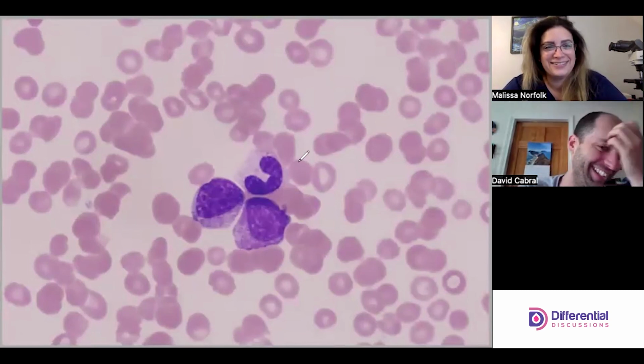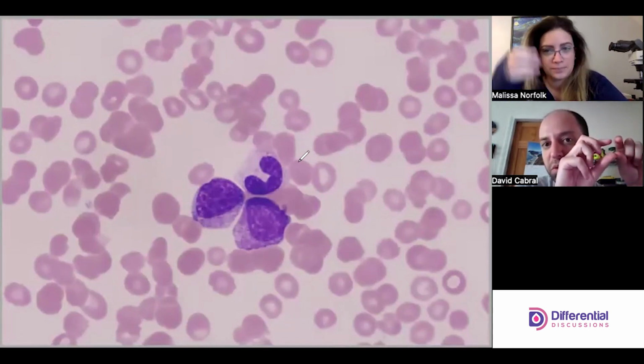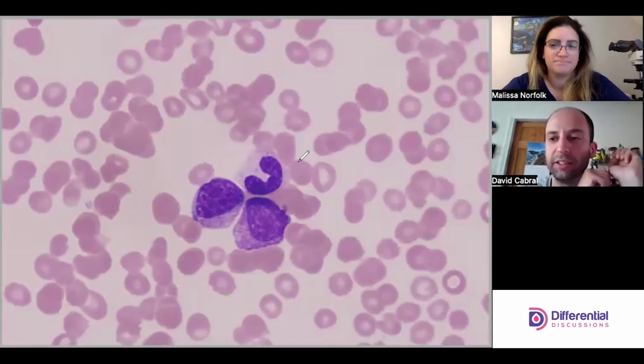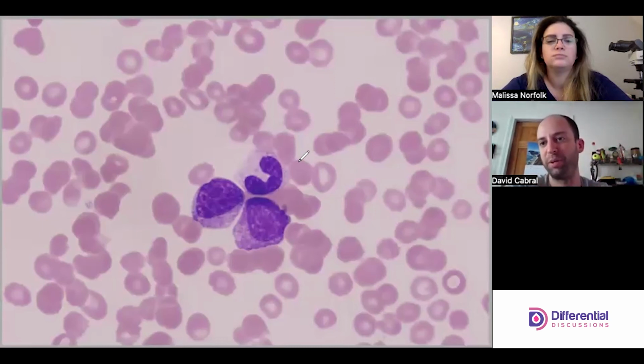Just tease them. So yeah, it looks like a neutrophil. And I want to be clear that we're really conservative about band calls. So we need the width of that nucleus to stay consistent throughout, making a C shape or an S shape or what have you. So those little deep tucks and pinches in, neutrophil. You know what it looks like?